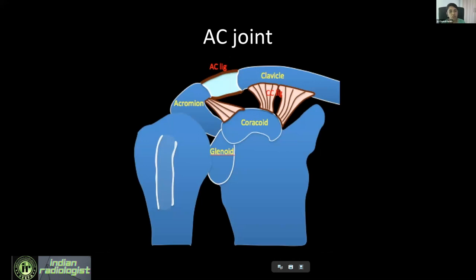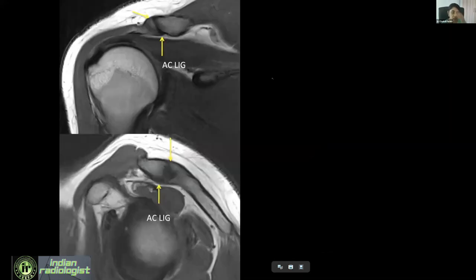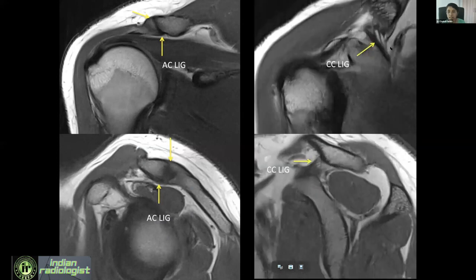The acromioclavicular joint is between the acromion process and the distal end of clavicle. It is stabilized by the superior and inferior acromioclavicular ligaments and the coracoclavicular ligament between the coracoid process and the clavicle. The AC ligaments are better seen on coronal images running along the capsule, where you can appreciate the thickening of the inferior and superior acromioclavicular ligaments. The coracoclavicular ligament is better evaluated on a sagittal image, where you can see the coracoid process, the clavicle, and the coracoclavicular ligaments.